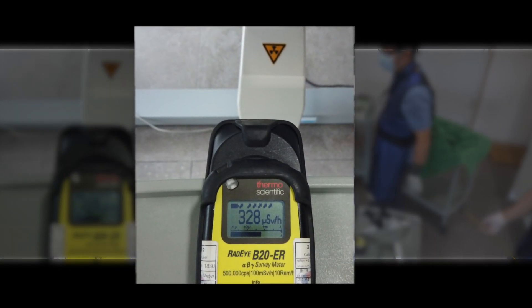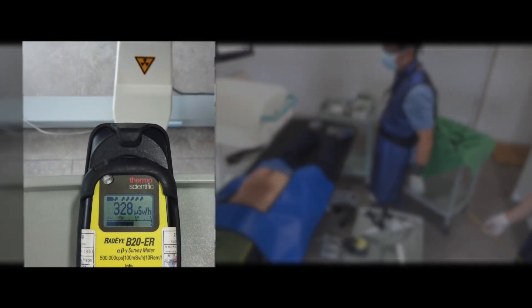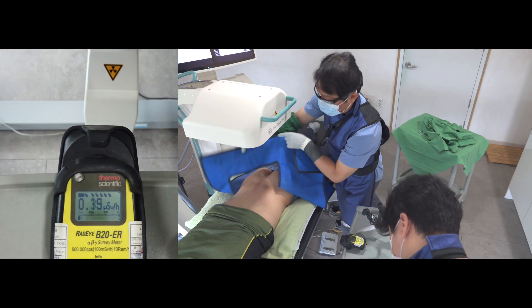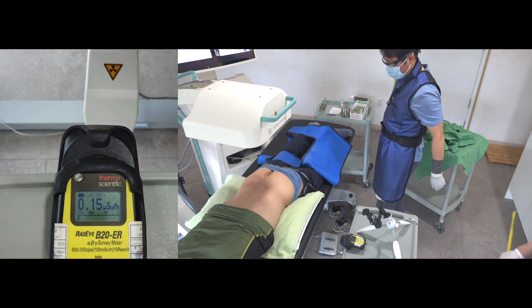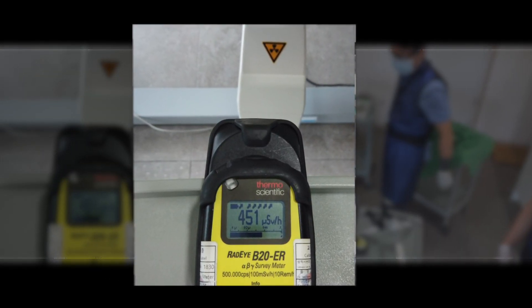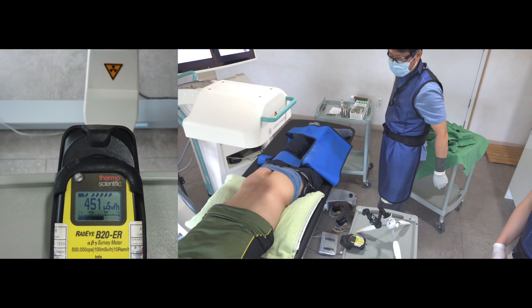Here is the measurement at the trunk level with the scatter drape, and here is the measurement at the trunk level without the scatter drape. Please look at the dosage — it is soaring.